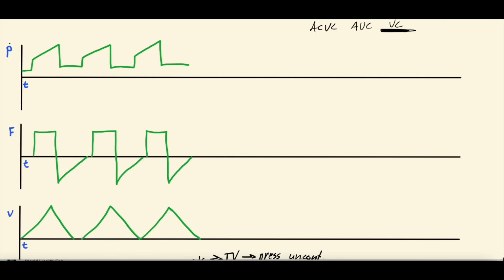The first one here is pressure versus time. So pressure on the y-axis, time on the x-axis. The second is flow over time. And the third is volume over time. And in volume control, the scalars you see are determined by how the ventilator is delivering the breath. All right. The volume scalar is the easiest to understand, so that's what we'll start with. So what you have with each breath, this is a single breath here. So this is one breath.